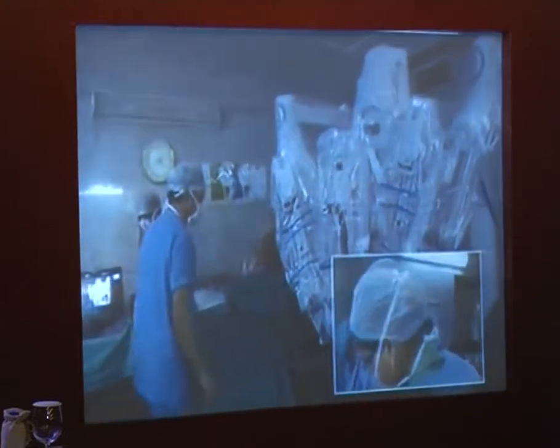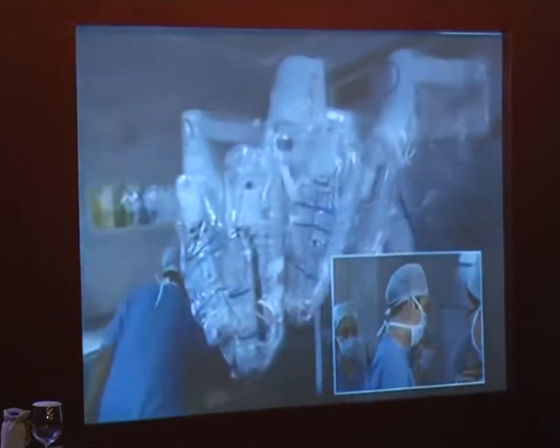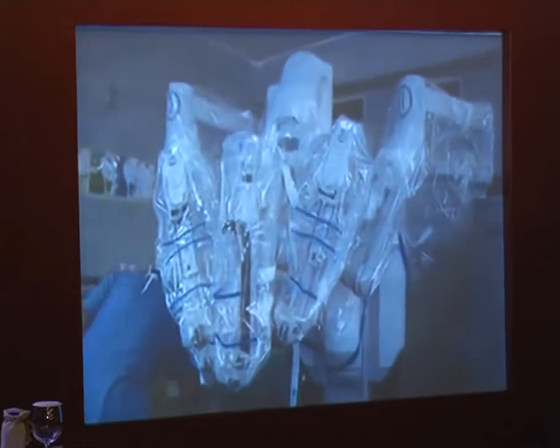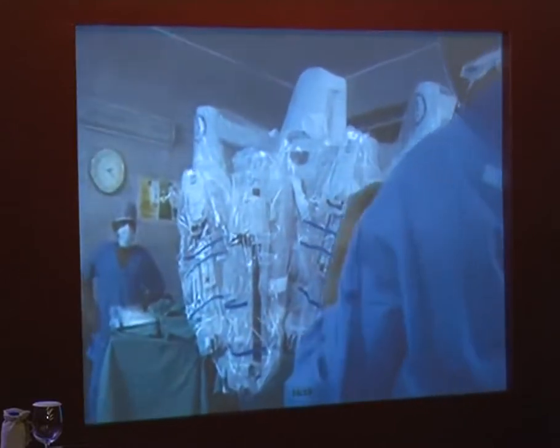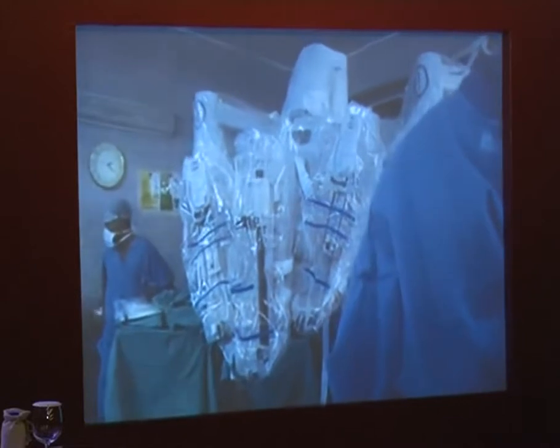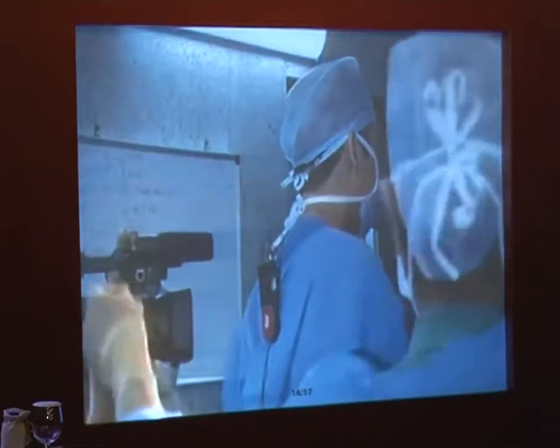Cut it hard. Yeah, keep cutting hard. Cut. Yep. Keep turning. Just like that. That's perfect. Okay, stop. Okay, go ahead and bring it on in. Straight. Just let me set the arms up here so we don't run into the thighs. Okay, go ahead. Keep bringing it in. Keep coming in. Straight.